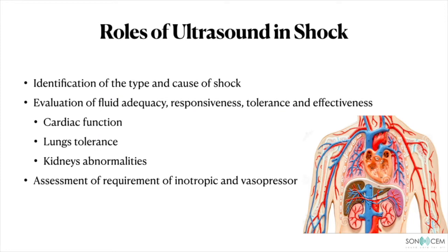Point-of-care ultrasound has many roles in the assessment of shock. Not only does it help us to identify the type of shock and the cause of the hypotension, it can also facilitate us to evaluate the fluid adequacy, fluid responsiveness, tolerance and also effectiveness.